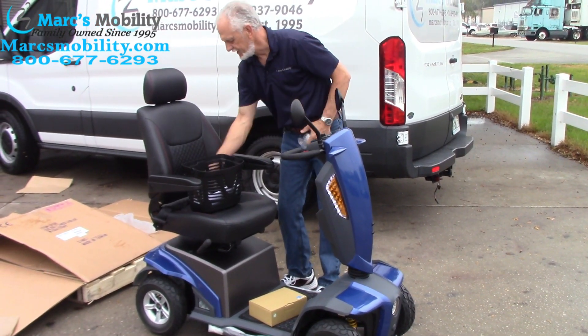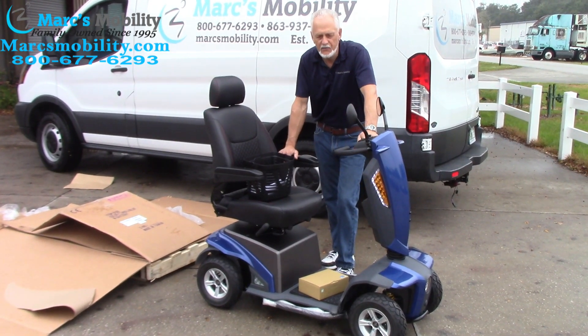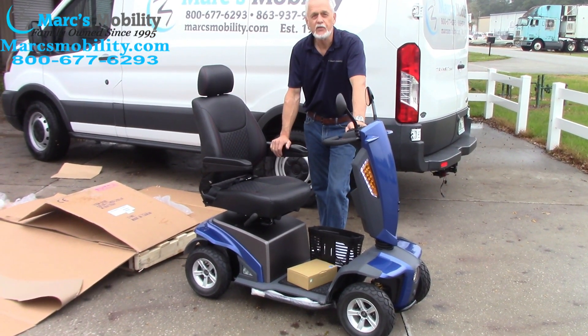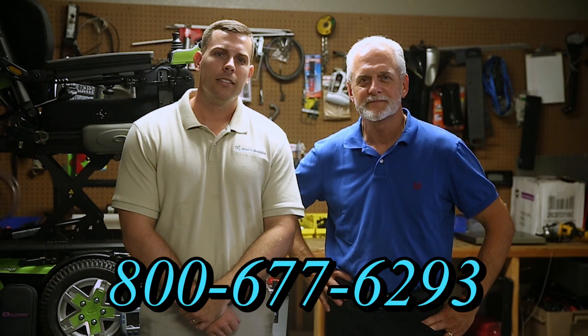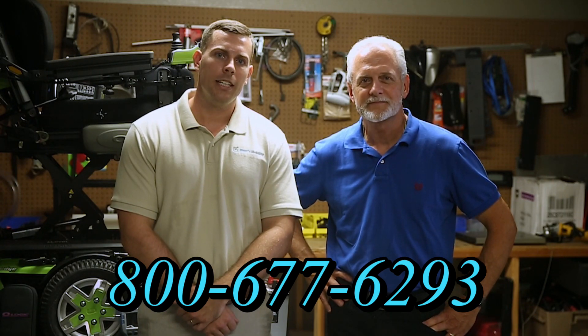Let me take the rest of the plastic out and put my knife back in my pocket. So folks, this is the Vita — how to take it out of the box. This is a beautiful scooter and I'm pretty sure you will enjoy it because it is a nice, beautiful scooter. Hi, I'm Mark, and my name is Alex. We are a family-owned business for over 25 years. We have many products available — not just what you see in this video. If you would like to learn more, you can call us at 800-677-6293 or visit us at www.marksmobility.com.